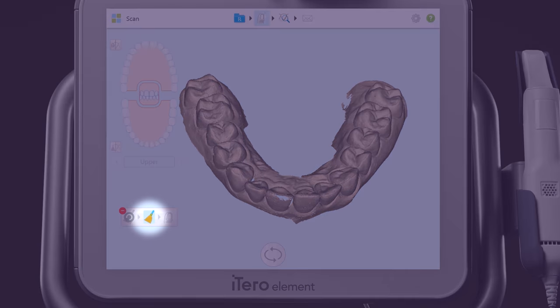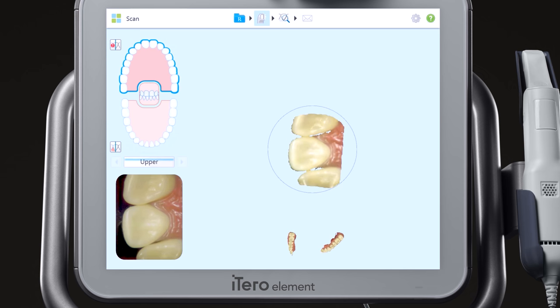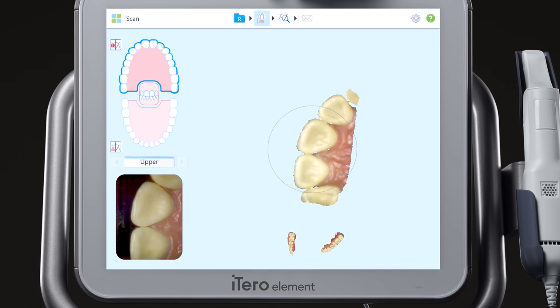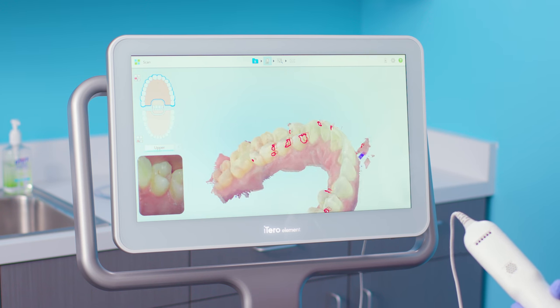I use the broom tool to remove any unwanted structures from the digital model. I use the fill tool to fill persistent areas of missing anatomy.